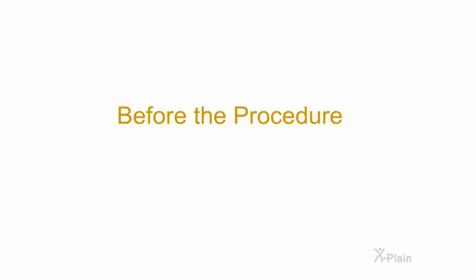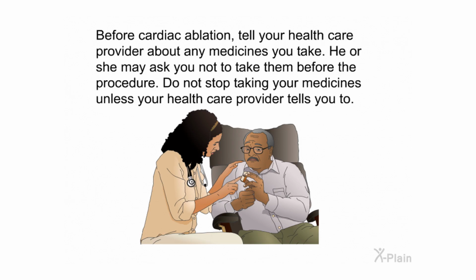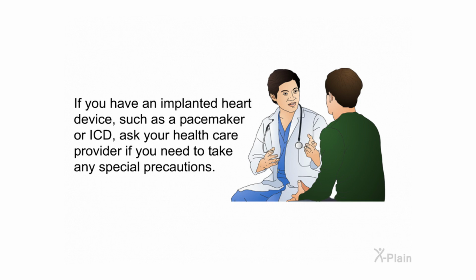Before the procedure. Before cardiac ablation, tell your healthcare provider about any medicines you take. He or she may ask you not to take them before the procedure. Do not stop taking your medicines unless your healthcare provider tells you to. If you have an implanted heart device such as a pacemaker or ICD, ask your healthcare provider if you need to take any special precautions.